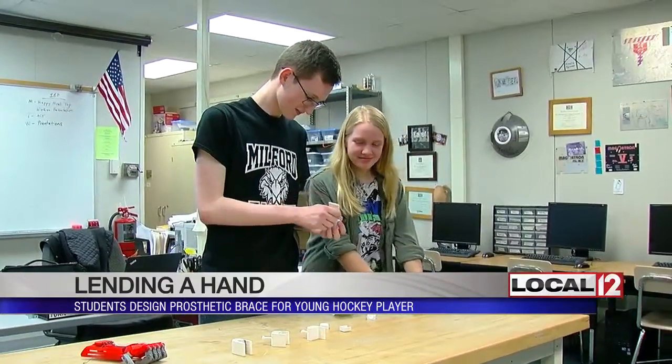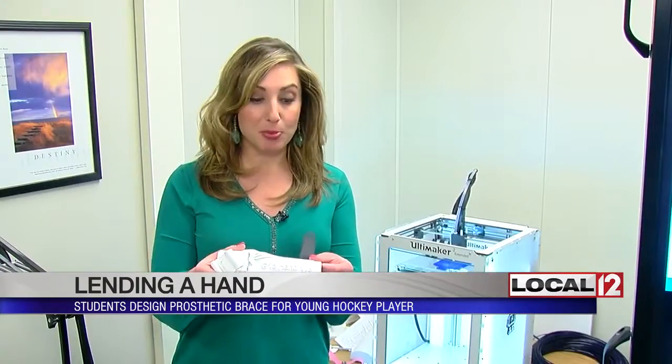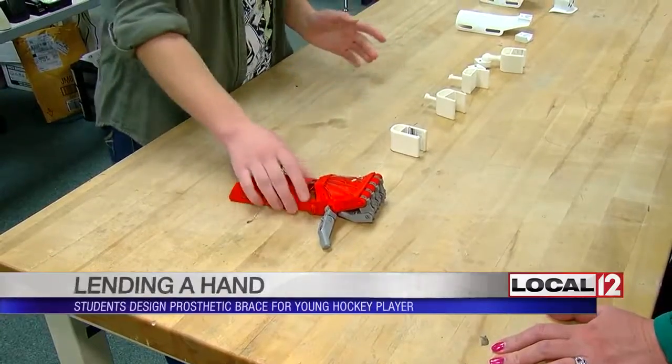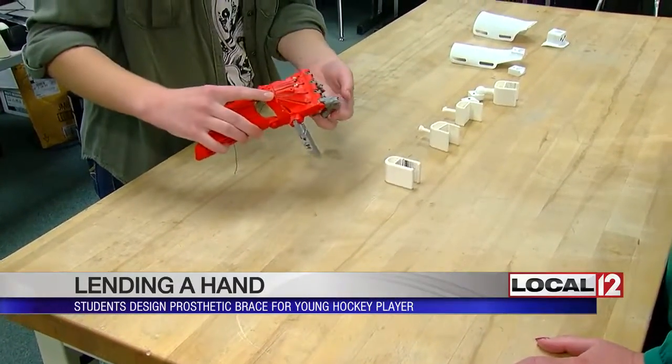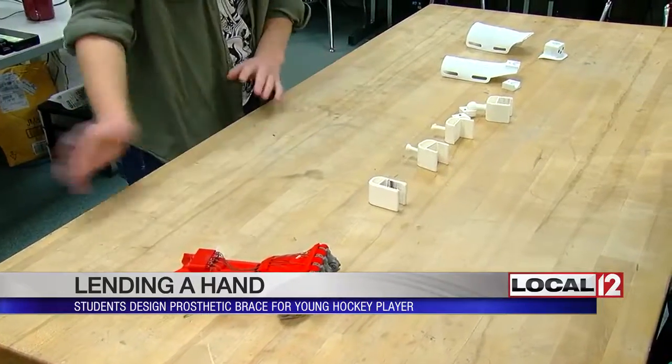What students Emmy and Connor designed is pretty awesome. Gabe's brace was printed right here with a 3D printer. It's called Grip Hand 3 because it took three tries to get it right. First, they tried something that looked more hand-like so he could fit his hand into his hockey glove with a naturally closed design — but that didn't have a good grip.